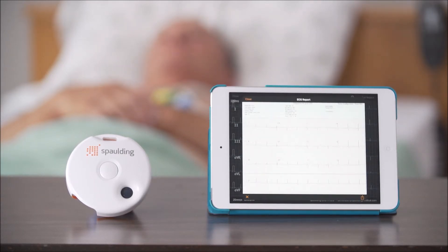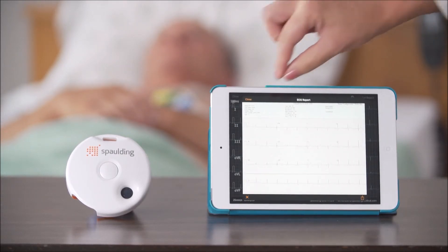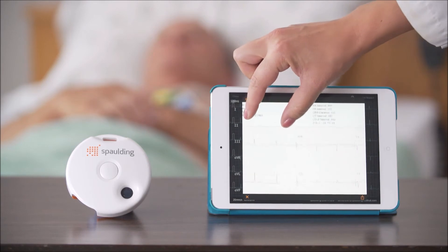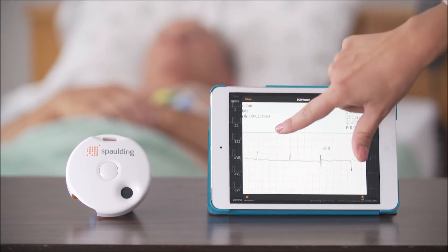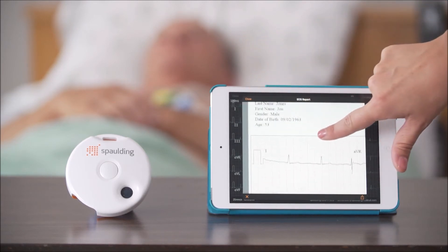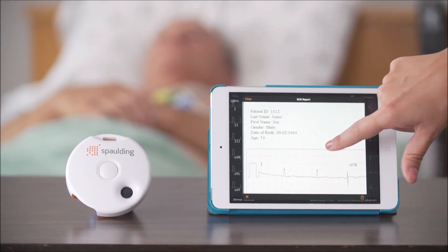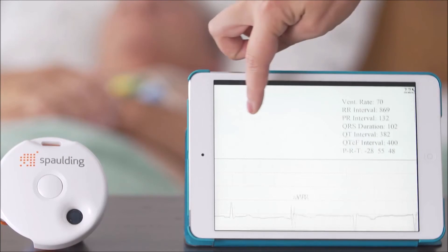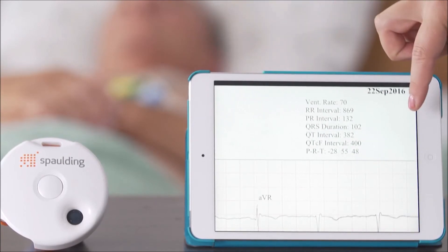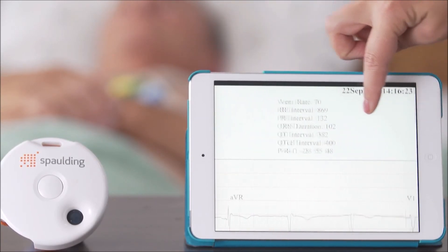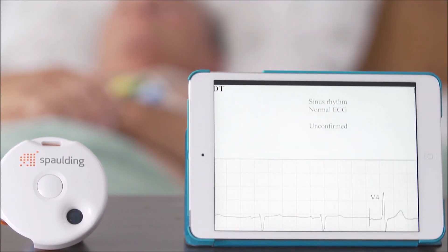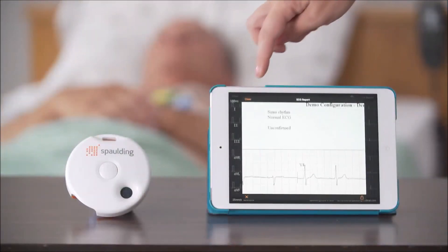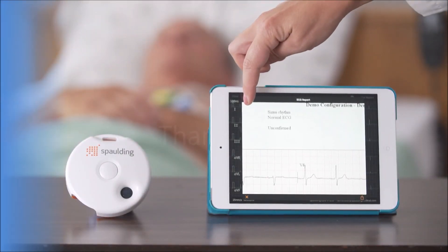Now you will see the report on your device. In the upper left-hand corner, you will see the demographic information, and in the upper right-hand corner, you will find the unconfirmed ECG interpretation. You can go back to take another ECG or move on to further workflow.